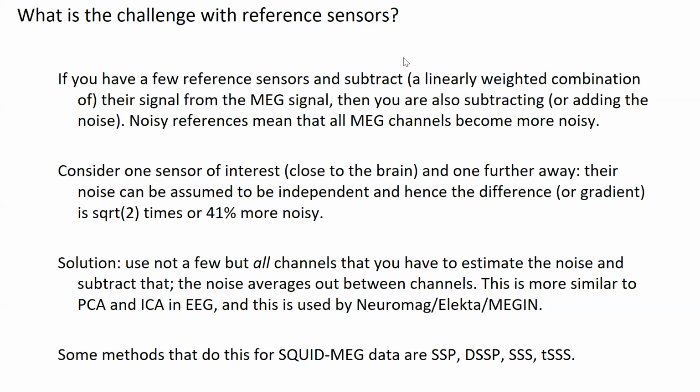It's one of the reasons that, with OPMs already being slightly more noisy than SQUIDs, the prospect of building an OPM gradiometer using two independent OPM sensors is not that attractive, because it will just increase the noise even further. So that's why people are working on making OPM gradiometers in hardware rather than doing them synthetically in software.